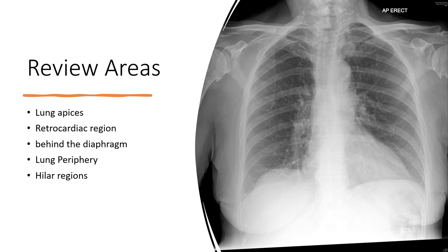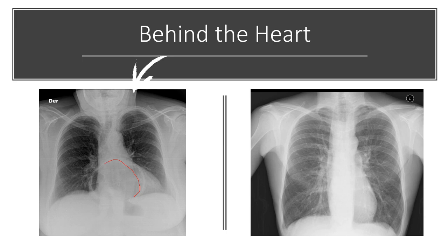Before finishing your assessment of a chest X-ray, always go back and double-check the hidden and commonly missed areas: the lung apices on both sides, the retrocardiac region behind the heart, behind the diaphragm, the periphery of the lungs, and the hilar regions. For example, in one chest X-ray you can see a left apical lung tumor suggestive of lung cancer. In another X-ray, a globular structure behind the heart is visible, sometimes with an air-fluid level — this is an example of a hiatus hernia.